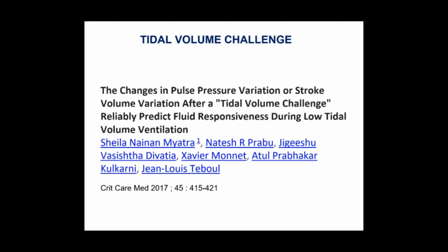Here we come to discuss some practical value of the tidal volume challenge. Remember in our previous lectures, we discussed that one of the limitations for the advanced hemodynamic parameters like pulse pressure variation and other stroke volume derived parameters under mechanical ventilation, when we calculate them and take a call regarding the fluid responsiveness of the patient, was that the patient should have at least 8 ml per kg tidal volume.